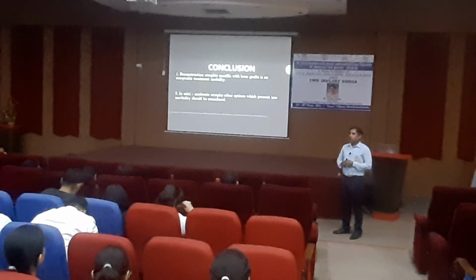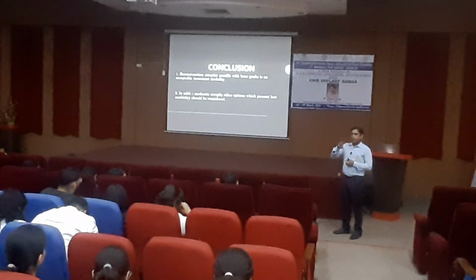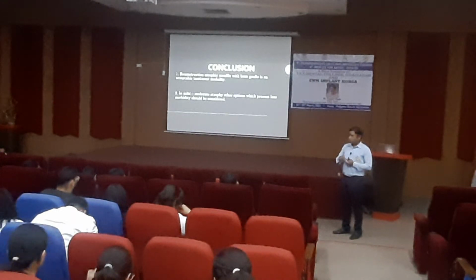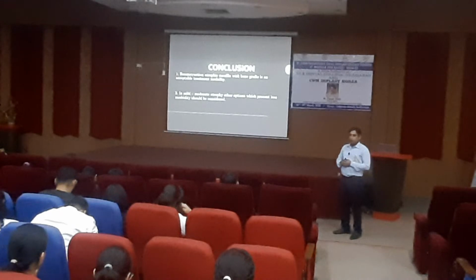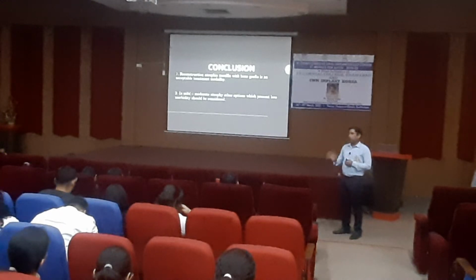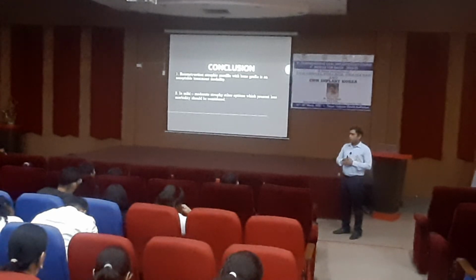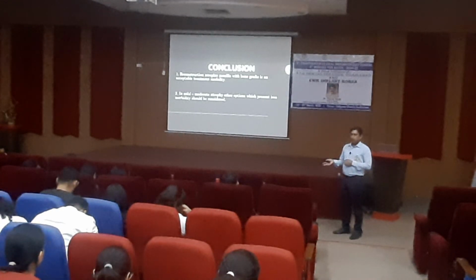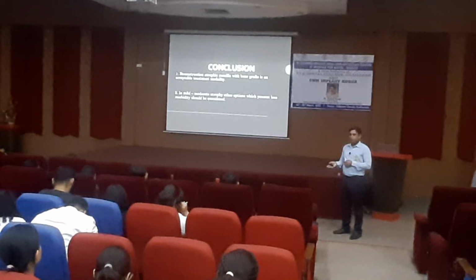Okay, because sometimes if you are placing an immediate implant in a molar area, okay, molar इतना बड़ा होता है, we have to extract it and place an implant. So how you close it back? So when you give a releasing incision, when you are not giving a releasing, when you put a graft, you should know. ठीक है, that is the only key of success for implant. More flap closure, more successful is your implant. ठीक है, more thicker the soft tissue, more success is the implant.